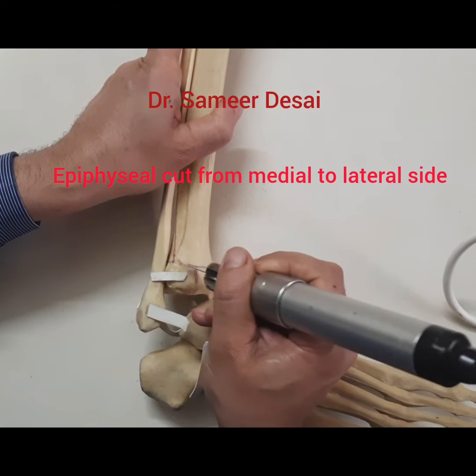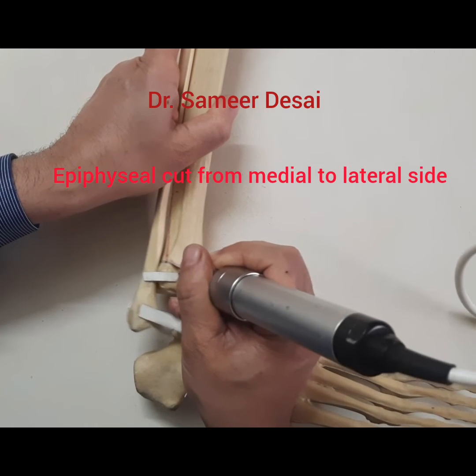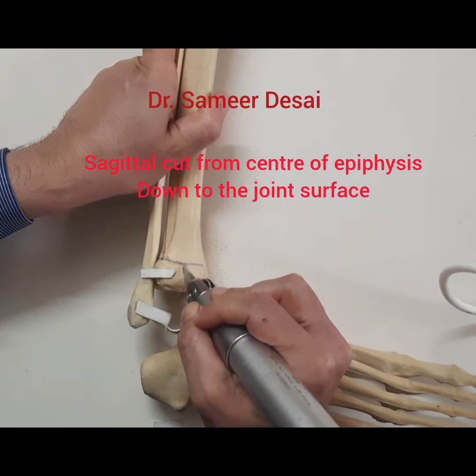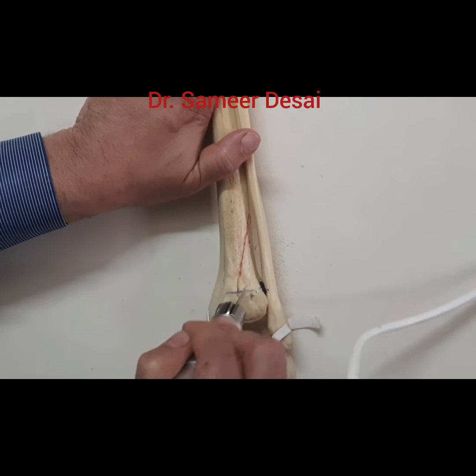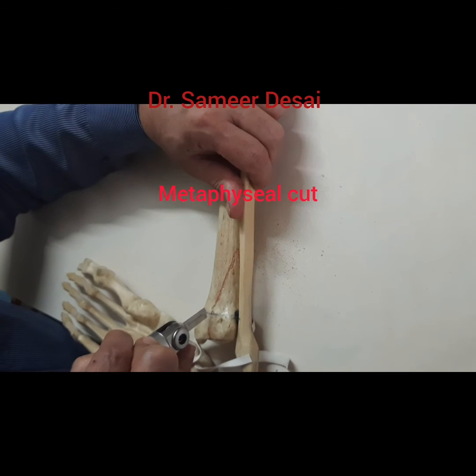We are now going to use a special saw to make the epiphyseal cut from medial to lateral side, the sagittal cut from the center of the epiphysis through the joint, and the metaphyseal cut.